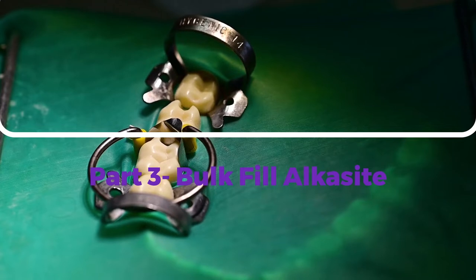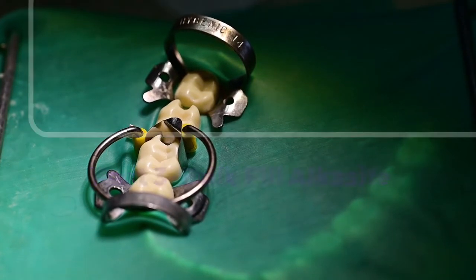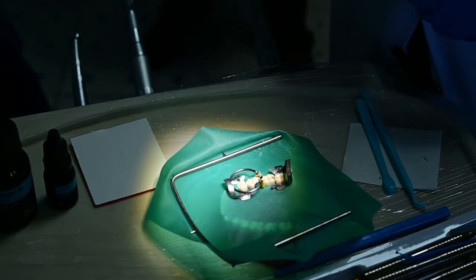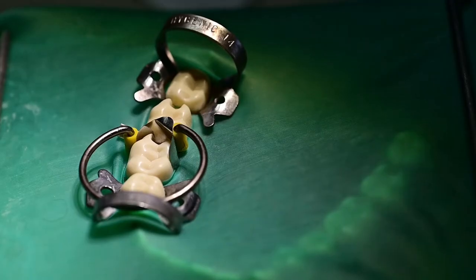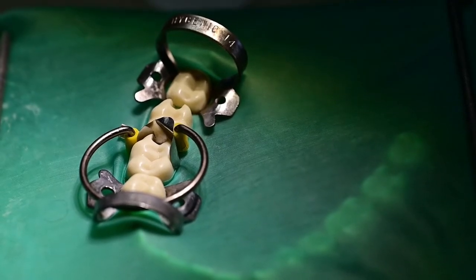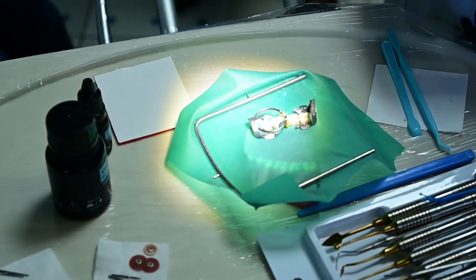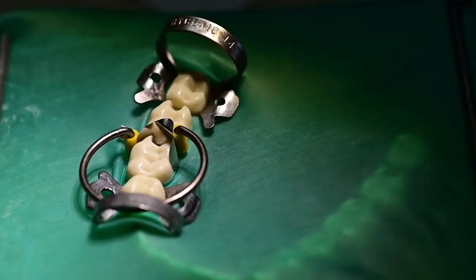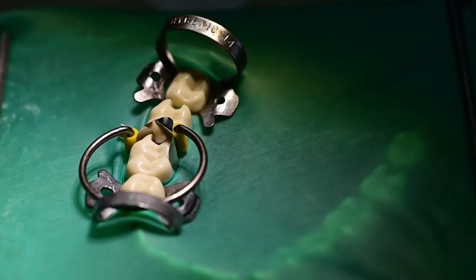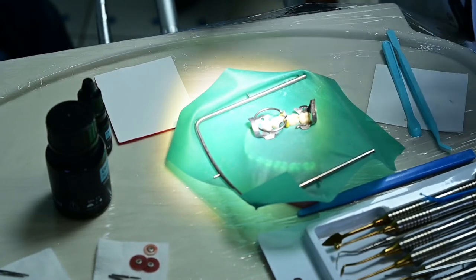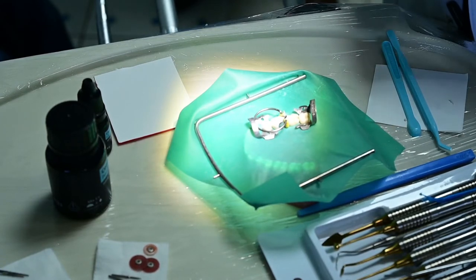In the beginning I said that we will be manipulating two resin composites. So now we are going to manipulate the alkaline filler composite. And the product that we are going to manipulate is one which has been very widely used as an alkasite. And that is Cention N. Cention comes in two options. You have self cure and you also have dual cure. It is actually the same material that is self cure that you can either use self cure or you can also add the photopolymerization, the light cure. And it is also optional for you to apply bonding agent or not apply bonding agent. So it gives you quite some flexibility. And so I will proceed and manipulate it.